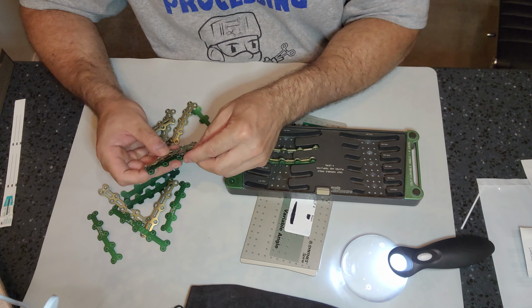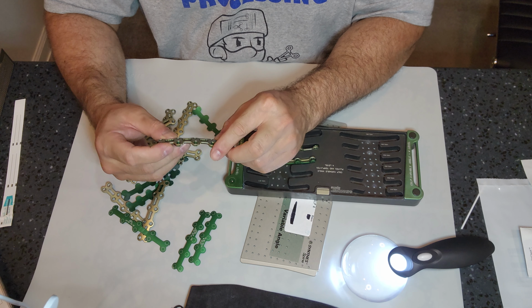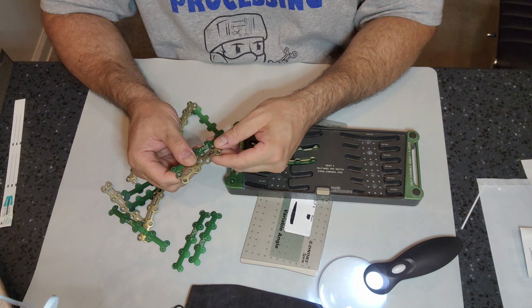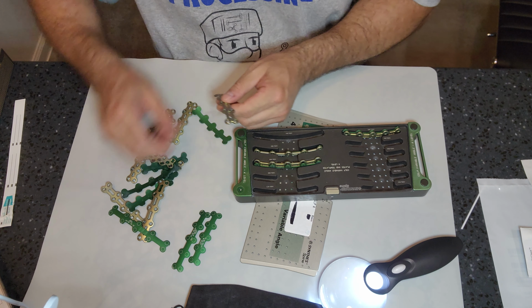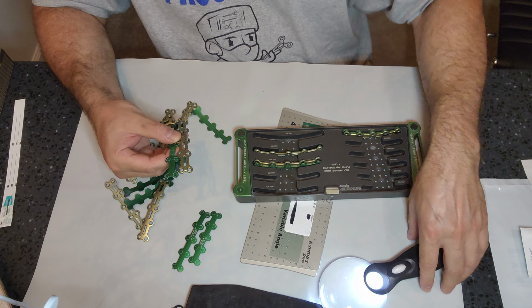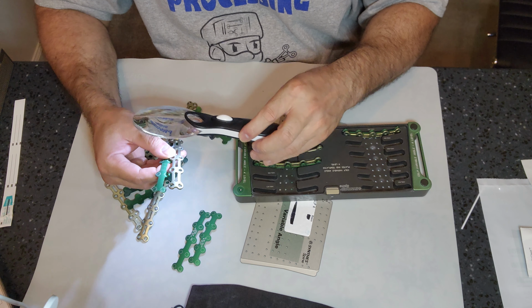You're inspecting every single instrument here, lining up these holes here. That one doesn't go with that one. This one doesn't go with that one. This one might go with this one. So this one is a 186, and this is a 186 as well, right? So that goes there. And I want you to notice the time it takes to do this very simple tray. This is a 450191. This is a 191 trial.